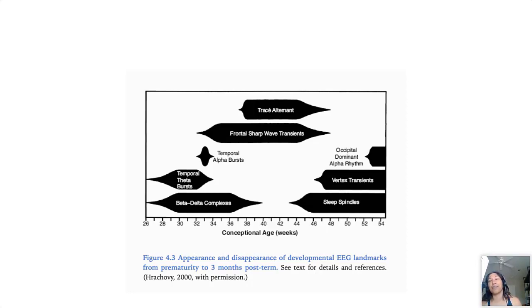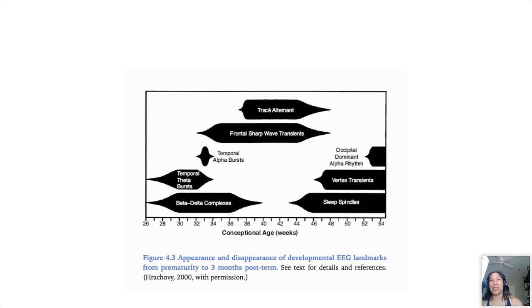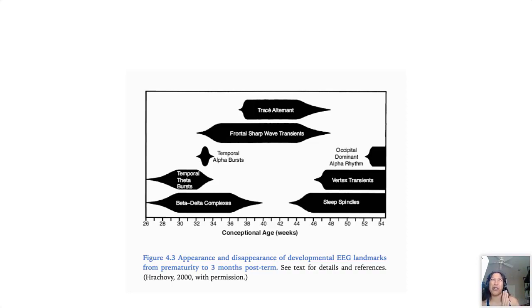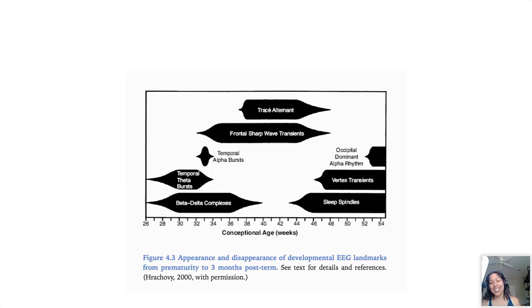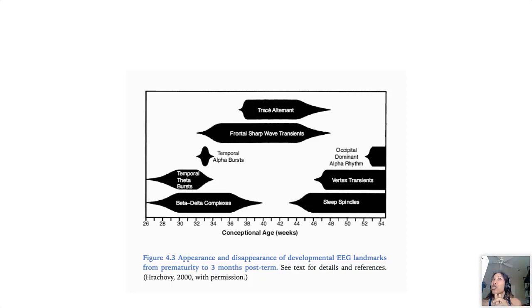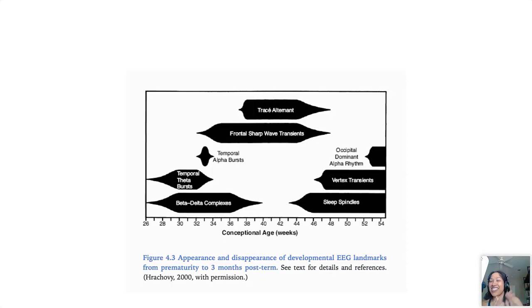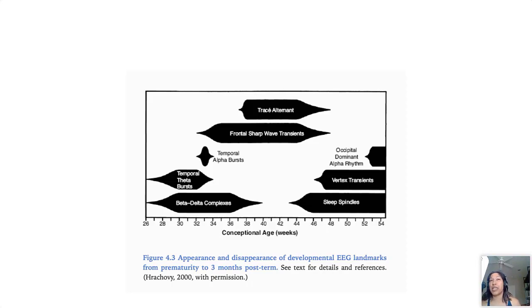Vertex waves, yeah those start at about six to eight weeks of life. And then that posterior dominant rhythm, PDR, or it's referred here as the occipital dominant rhythm, ODR, that comes up more like two to three months of life. And for the pediatric epileptologists we deal with this every day, but I know for the adult epileptologists have to look at tables for these things. But essentially we think of the PDR starting at around three months and being around three hertz at three months, and then it goes to six hertz by around one year, seven hertz by around two years, eight hertz by around three years, and then nine hertz by nine years-ish. It's kind of just the frame of reference that we use to know if a PDR is appropriate for age or if there's slowing for age.